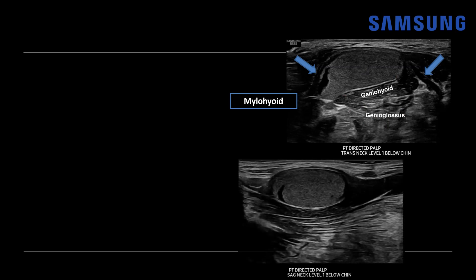Turning to the sagittal view, here's the mandible as a landmark. Again we have the mylohyoid muscle draping over this ovoid mass, which has a pseudo-solid appearance. Then we have the geniohyoid muscle, and here we can better see the genioglossus muscle and its fan shape. If we continue this way, moving closer to the oral cavity, we get into the tongue.